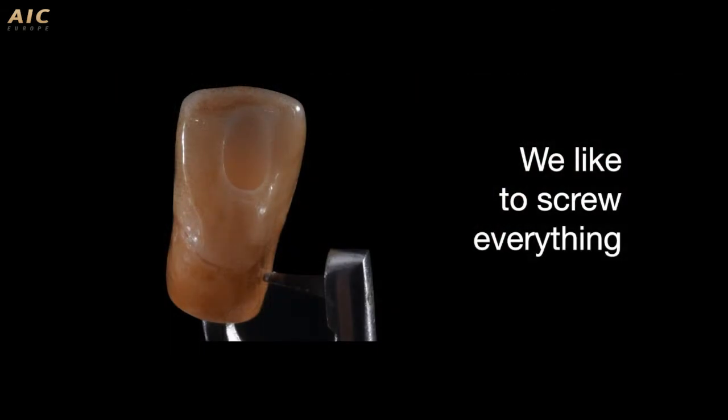Why do I choose this with my crown? Because we like to screw everything. We don't like the cemented crown, but we like the screw crown, because in our opinion the screw crown is simpler to control and simpler to watch during the follow-up, and in this way we can keep the implant and the soft tissue around the implant clean.